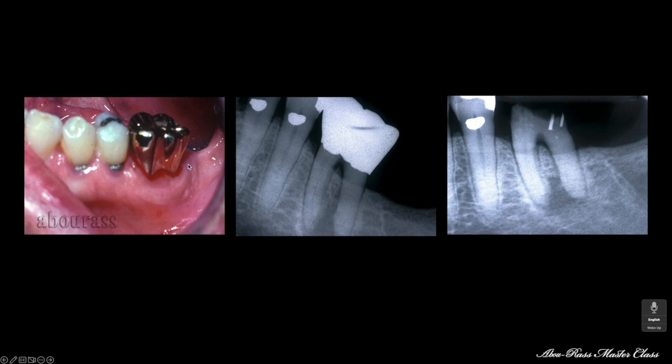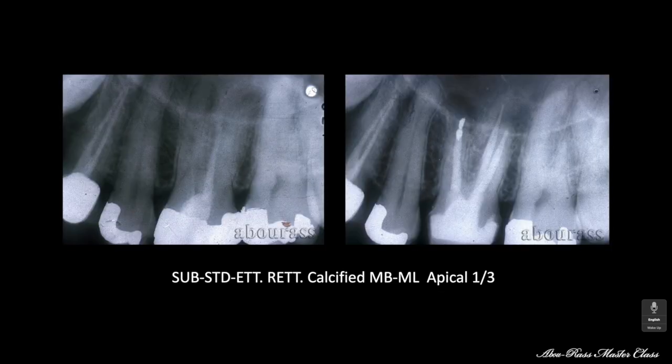And you see here, we removed the crown. We did not expect this. These pins did the job. Perhaps it was a pulp cap. The bottom line here is impassable calcification for a patient who was in a hospital when I did this diagnostic exploration.